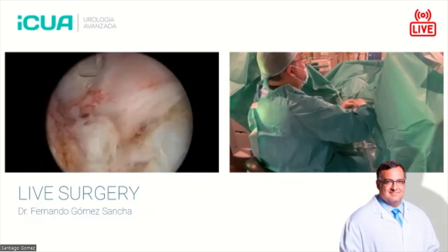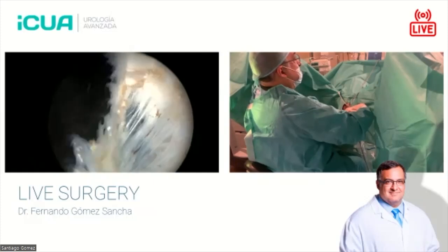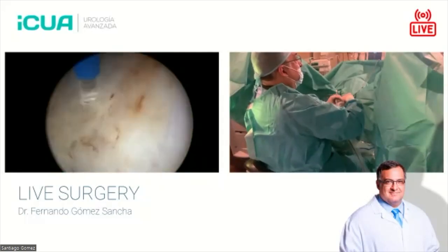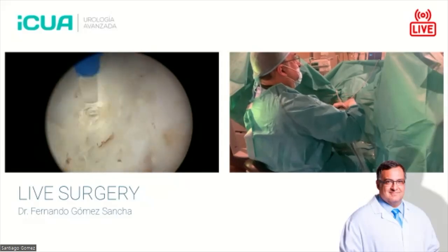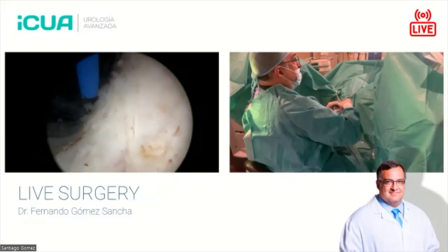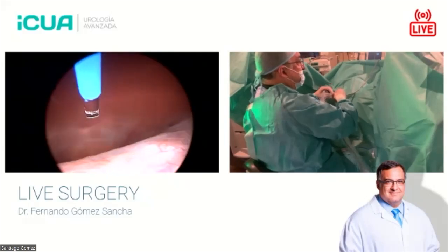I try to go, and here, you see, here we are reaching the bladder neck again. So we are now starting to cut the bladder neck in the posterior aspect. We did the anterior, now we do the posterior. There's a moment here when you can enter the bladder and check where is the UO. So here I'm going to enter and check.